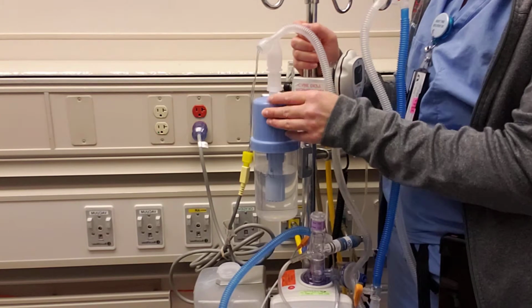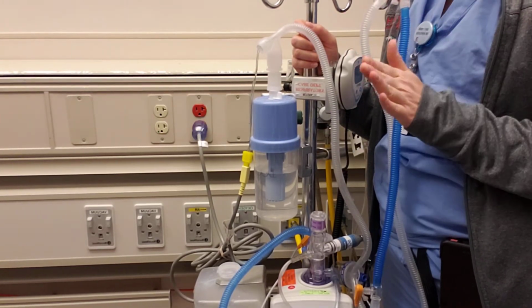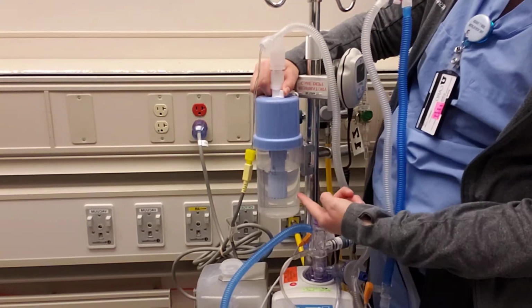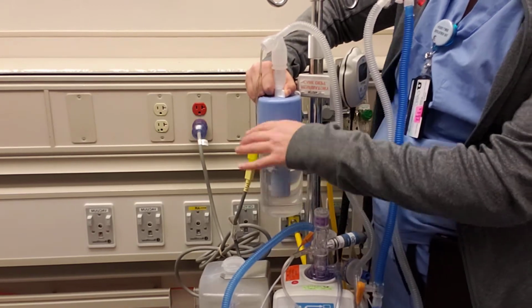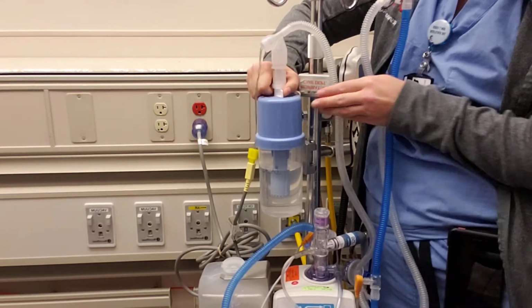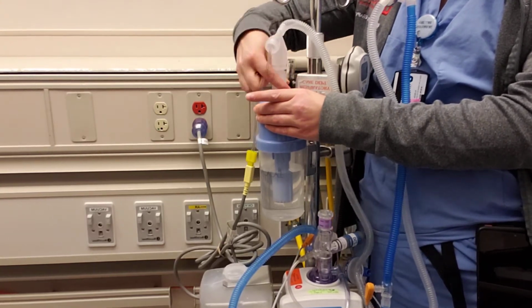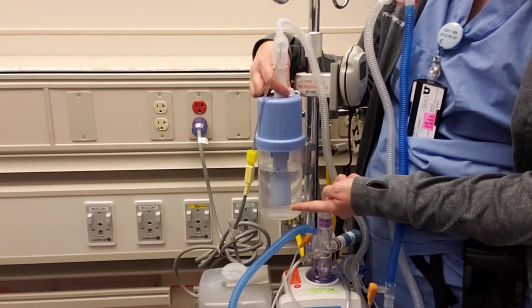This is just my own personal brand of crazy. I like to start at 7, lucky number 7. It's in the middle and it gives adequate pressure. But watch this column here inside the water as I change the dial. It goes up and down because we are actually measuring centimeters of water pressure.